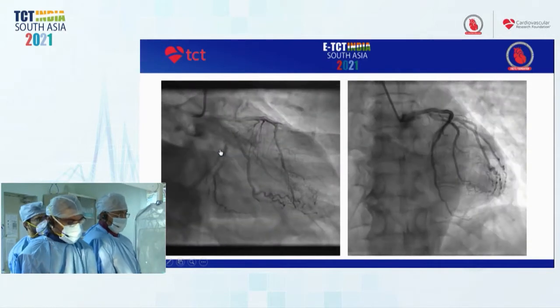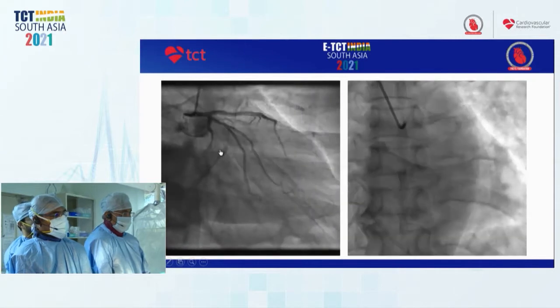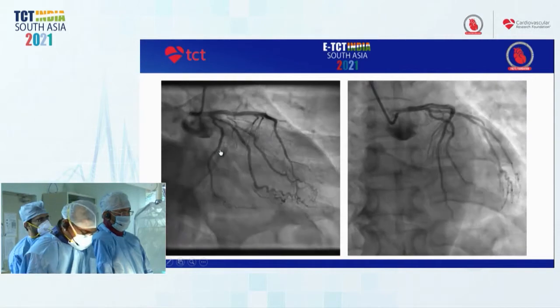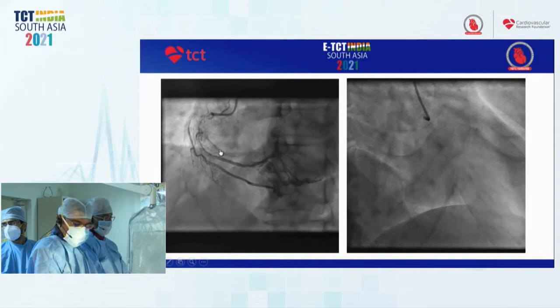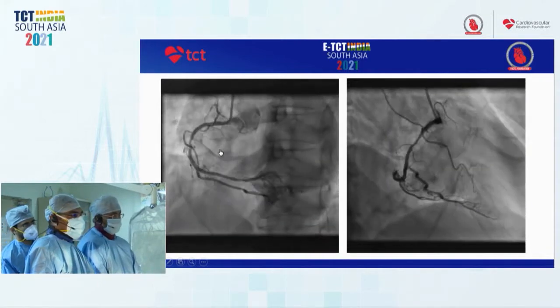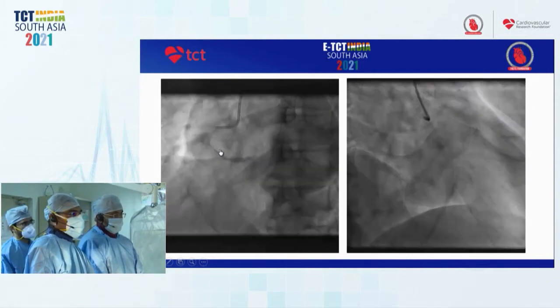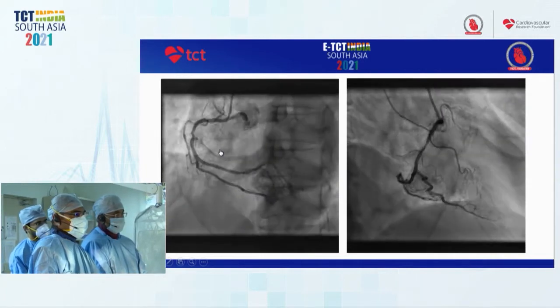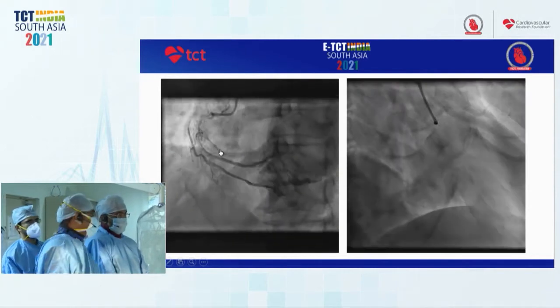So I'm not going to show you the older angiogram, but here is today's angiogram, where you can see the right coronary. The right coronary shots show that there's some disease in the right mid-segment. There's about a 50% stenosis in the right. And so we went ahead, took the other view on the right, and you can see the other view on the right showing again a 50-60% stenosis.